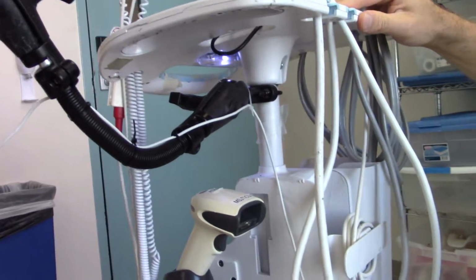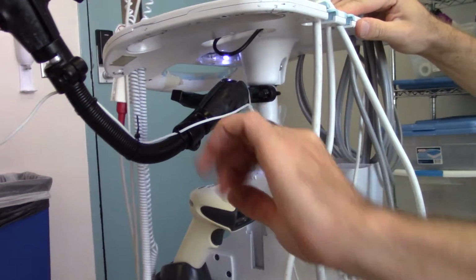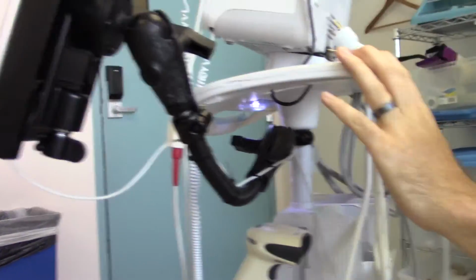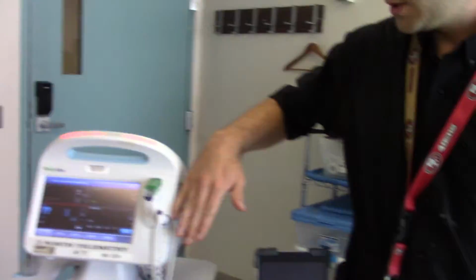So you'd say you could replace this one with just a rigid arm. Yeah, as long as you just had something pre-built and rigid, where you said, okay, this is the angle it's going to display out. Maybe make it parallel with this display up here. Would you stand up for just a moment? Yeah, absolutely. Just to give me scale, just stand beside it. Okay. So you can see.